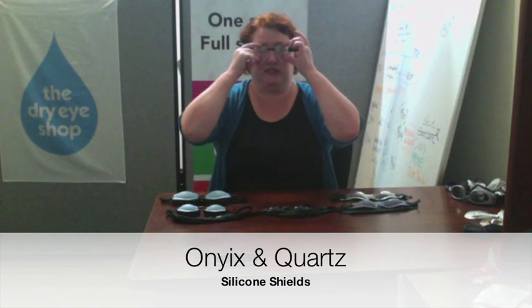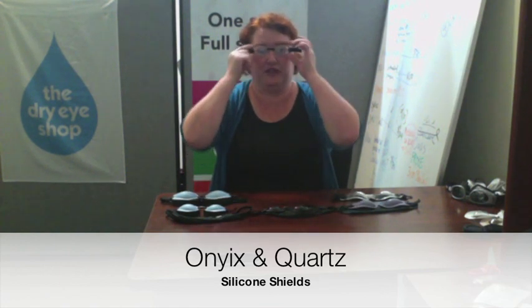For me, this pretty much starts fogging up the moment I put it on. So if you're visualizing it as something you can watch TV through, you're probably out of luck. I know some people who manage to. They're probably in dry climates. I don't know. The fit varies a lot from person to person. As you can see, for me, it's kind of within my orbital bone. It's under my brow, over my cheekbone.